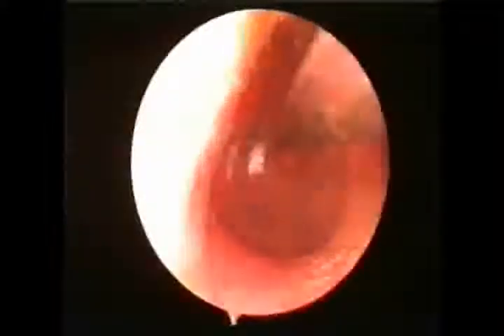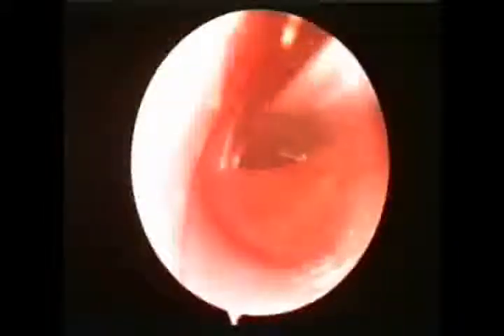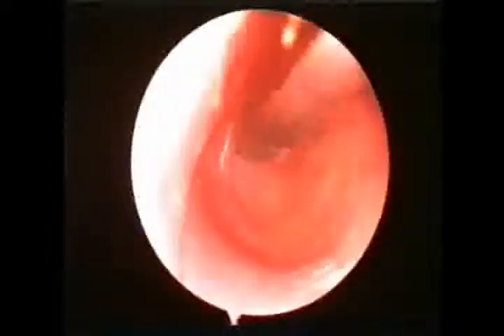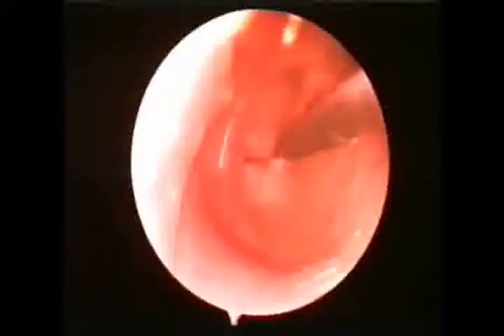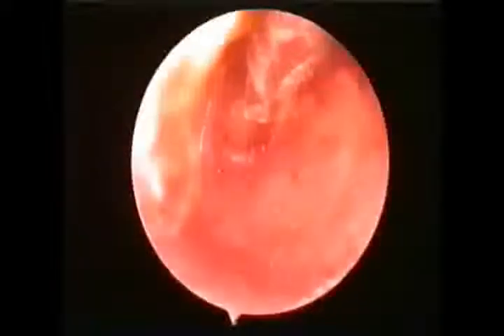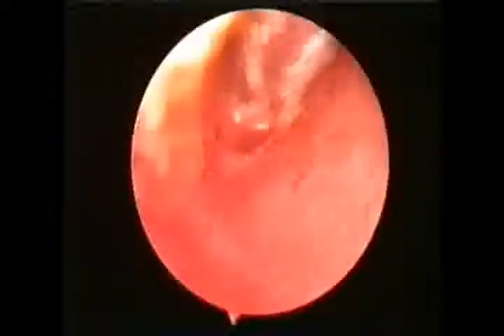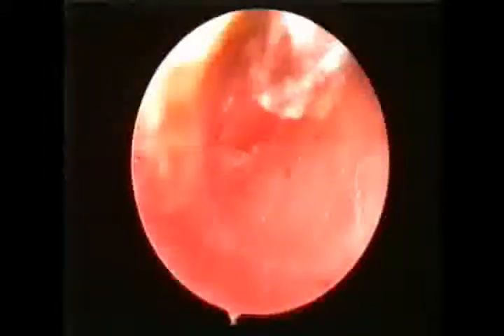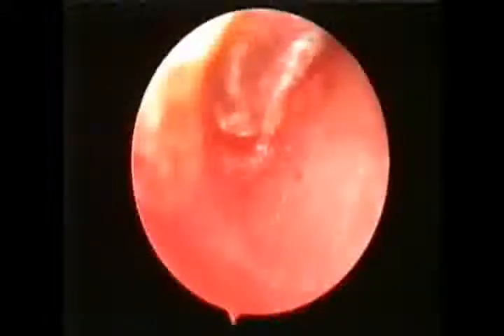The procedure starts with incision of the tympanic membrane in its antero-inferior quadrant. Then, the fluid is suctioned through a wide-bore suction tip.